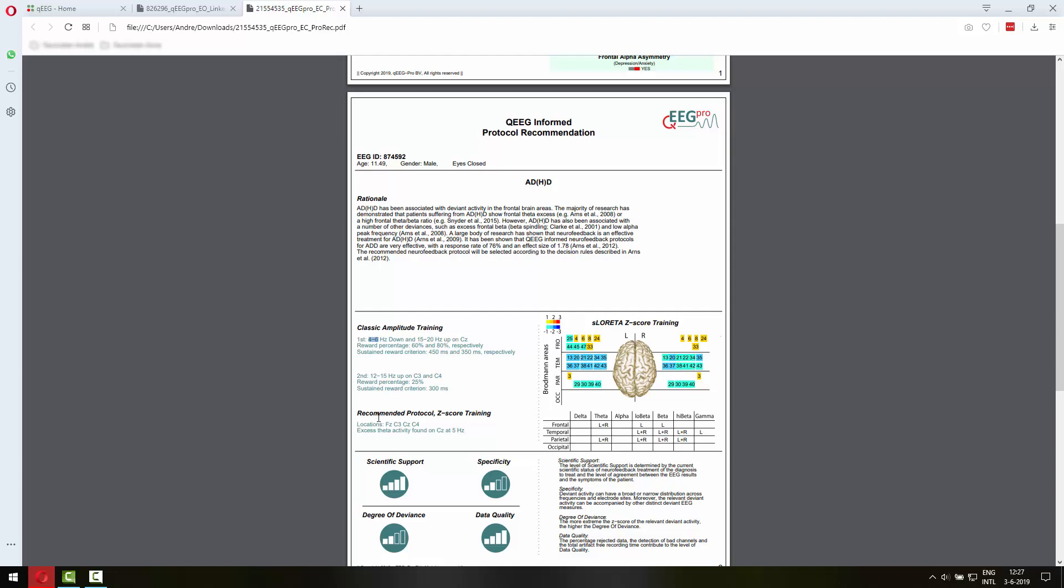Then there's a second protocol recommendation and a recommended protocol for 4 channel Z-score training and for sLoretta Z-score training. This information is actually not enough to construct a protocol in the Brain Avatar software or any other software that supports sLoretta training.